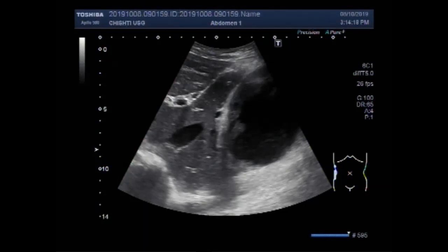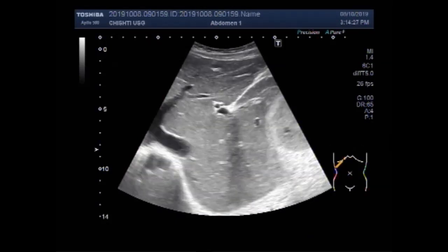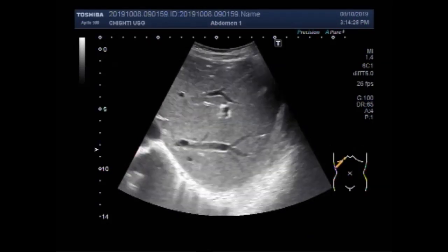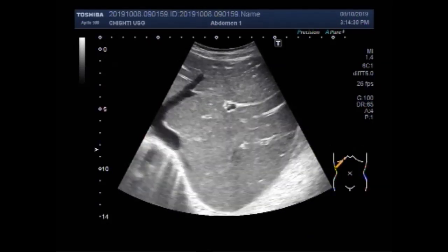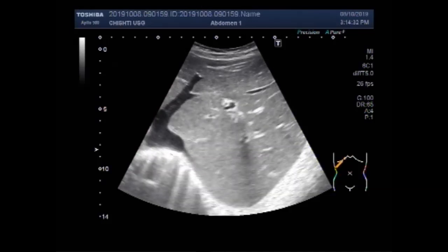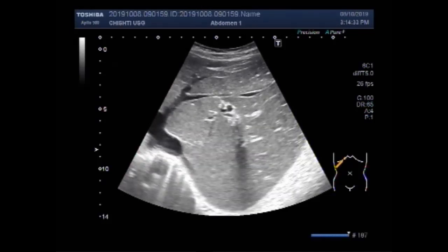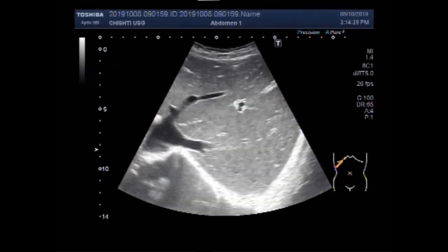Dear viewers, I hope you are all fine. This ultrasound video shows a large cystic mass in the upper pole of the kidney. You can see the liver and it looks ecographically normal — normal in size, shape, and echo-texture.